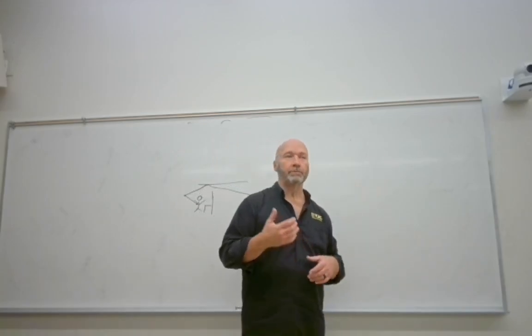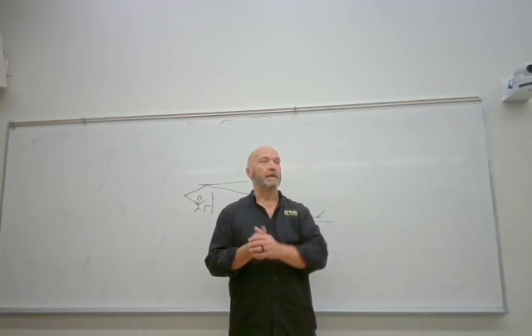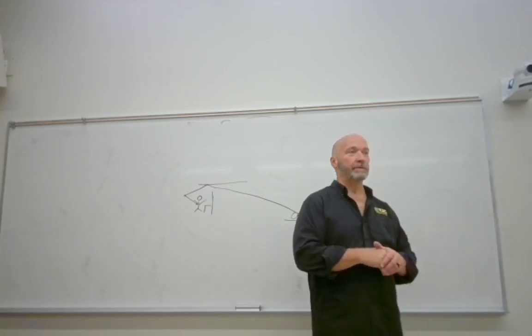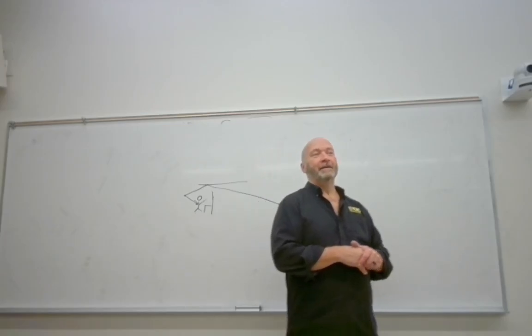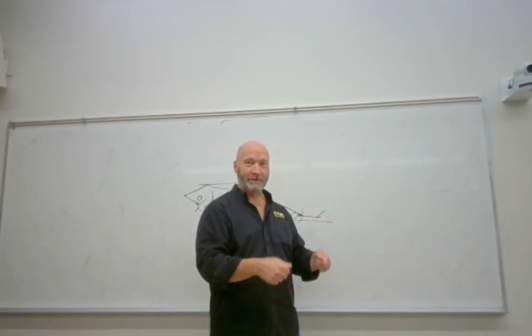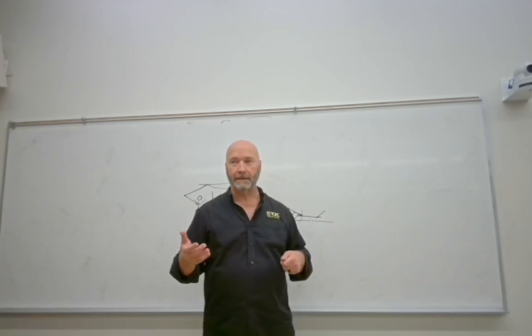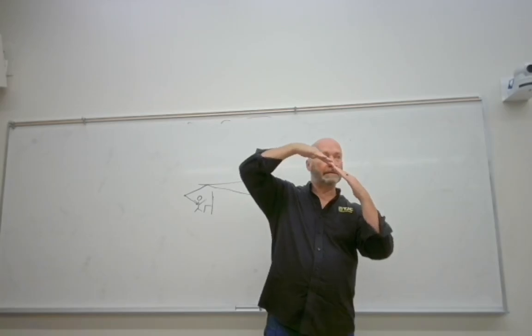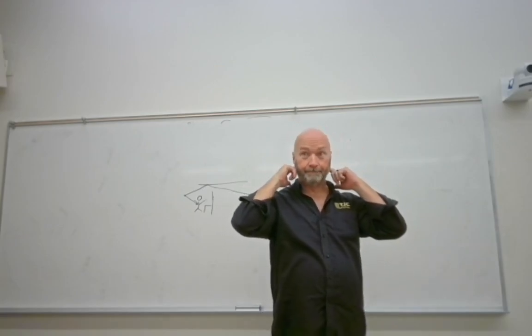All right. So anybody done a lumbar myelogram or a cervical myelogram, let's say? Okay. So what do you do with a cervical myelogram that you have not seen with any other procedure specifically? Now remember, you put the patient's feet in the boots and you strap them onto the footboard of the table, and we'll talk more about that later on. Then you'll take that table and tilt it so that their head is down. It's in Trendelenburg to try to get that contrast to run up into the C-spine.